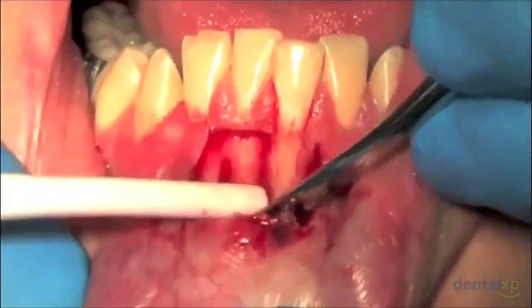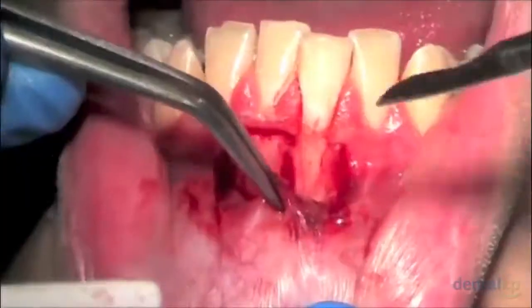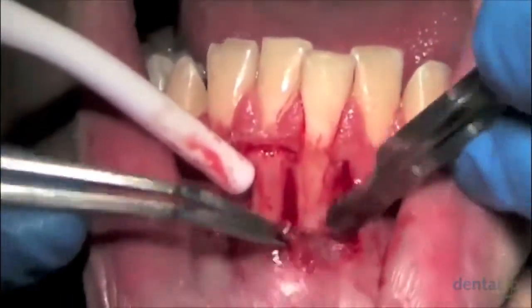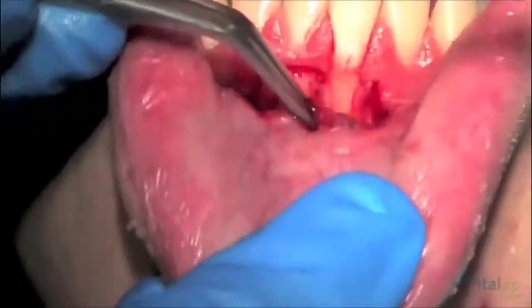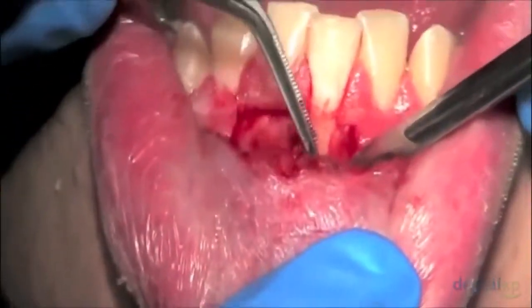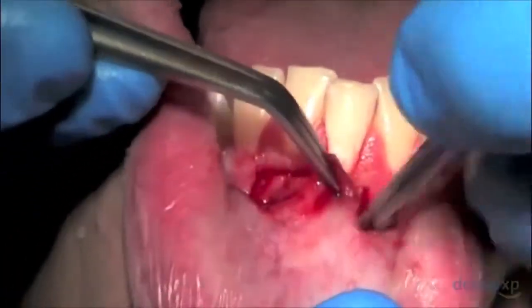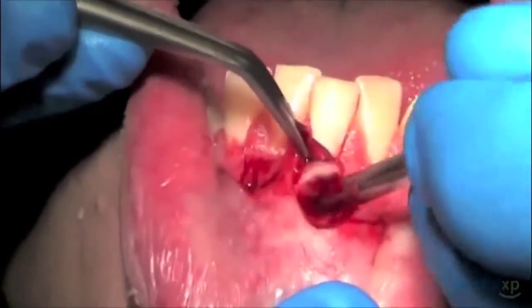With the flap now reflected, you can see how prominent the underlying roots are and how thin the overlying bone is. You can also see how an orthodontist would be concerned with the upcoming tooth movement. In cases such as these, during the course of correcting the anterior crowding, the tooth can sometimes be moved literally through the labial plate.